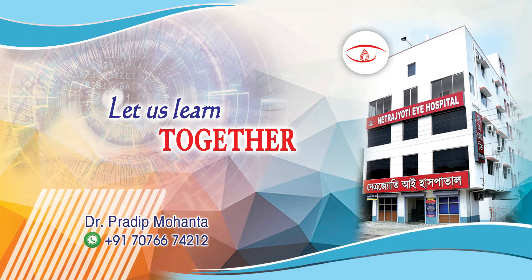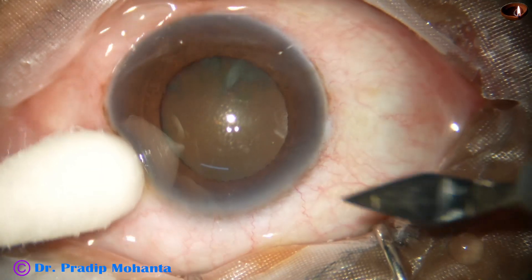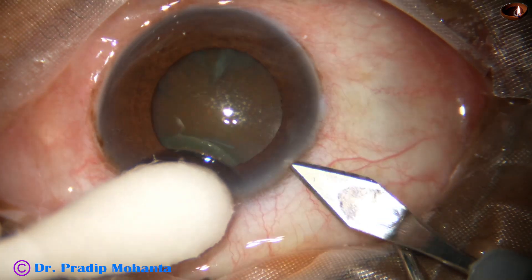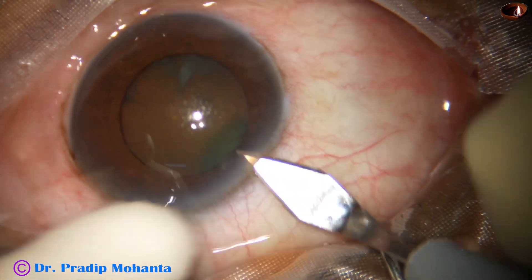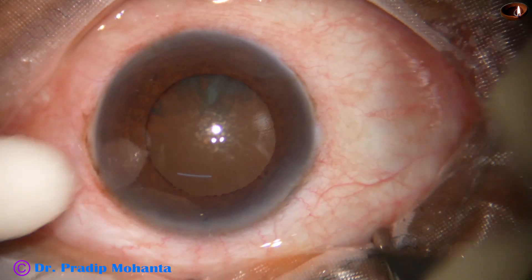Dear colleagues, welcome to my workplace at Ranaghat, West Bengal, India. Let us observe this surgery. The pupil is mid-dilated, and we will see later that the patient is having mild floppiness of the iris.